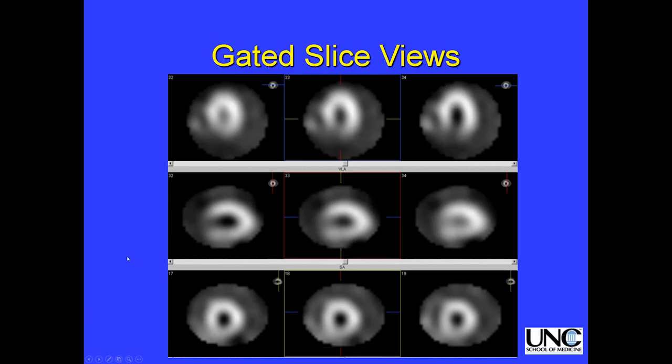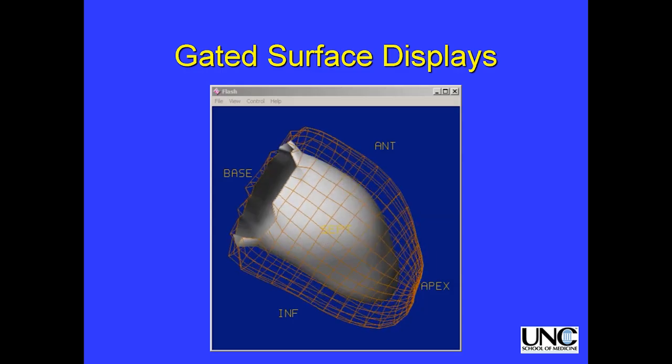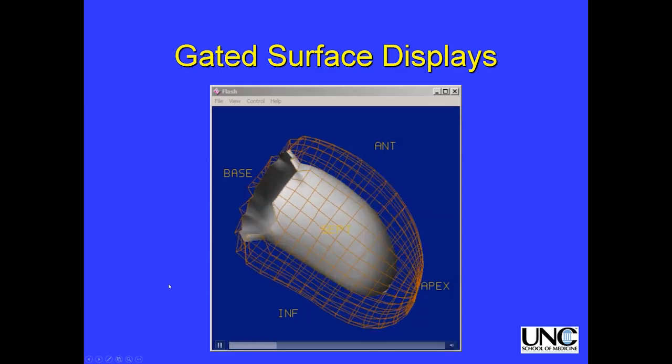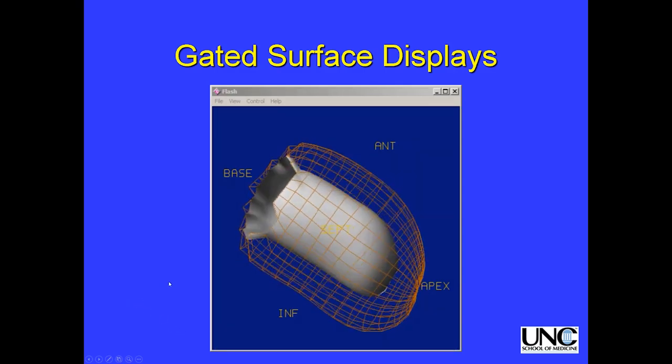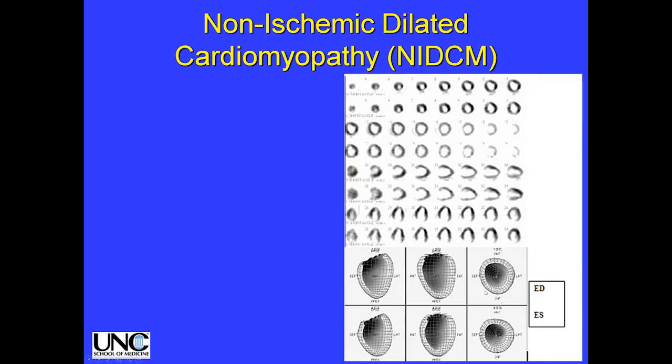So again, you could choose to use one of the two categories of scales exclusively, but it's important to know the differences and potentially use them where they might be helpful in certain situations. And this is just a volume rendering of the myocardium. Again, it looks aesthetically pleasing, but if artifacts creep in and we don't contour that properly, this can look quite abnormal. So it's probably a better idea to look at the raw SPECT images than rely on some sort of a surface rendering software.